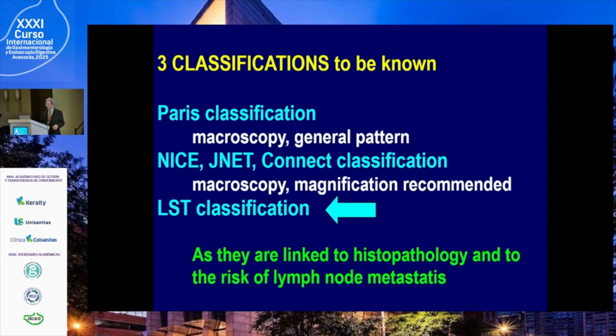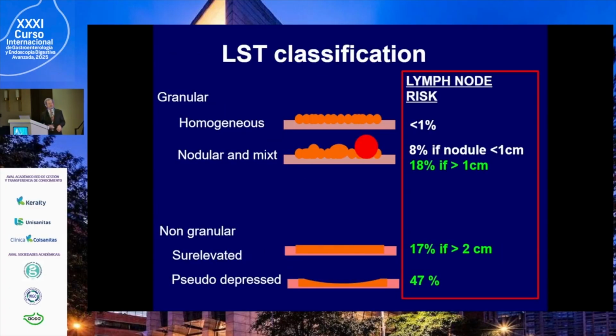LST, of course, it is interesting. But of course, I will not insist. Of course, whether the lesion is non-granular, there is a high risk of submucosal carcinoma, high risk. When it is homogeneous, granular, such as your case, the risk is very low. So in this case, you can take the risk of piecemeal. But here, you should perform ESD.